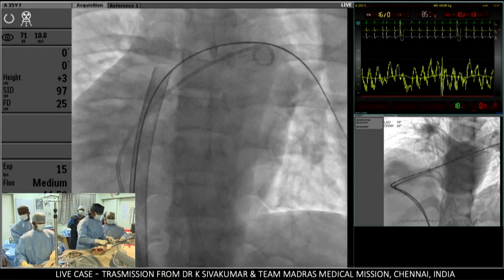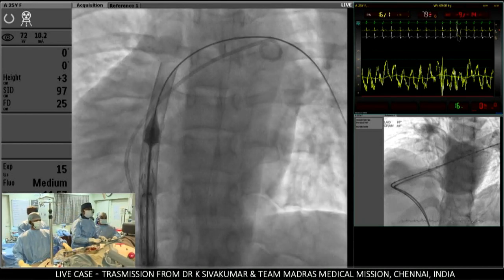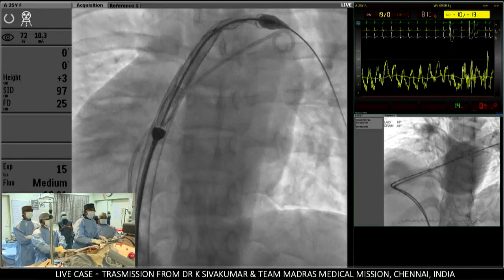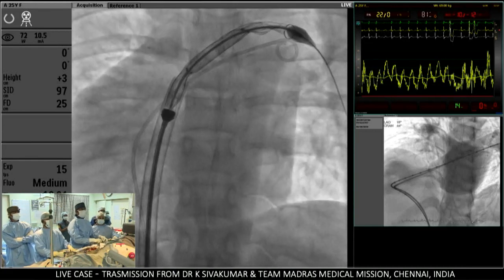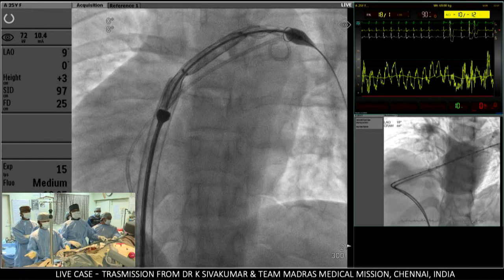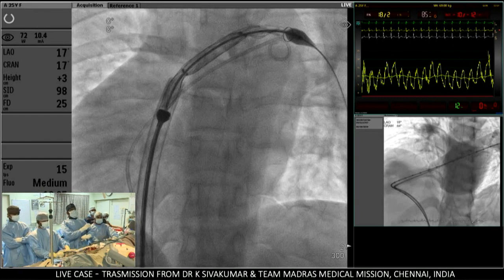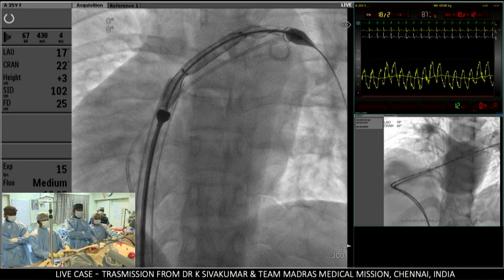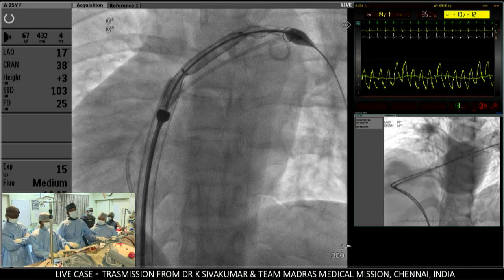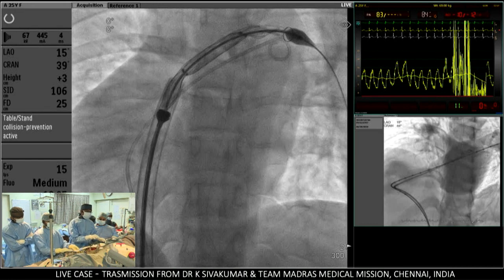I think provided you can put a valve in, there is no way that the stent will be in contact with the wall in the main PA. And I wonder if your intention is to put a valve partially straddling the more restricted point and the RV to PA junction, or what? Yeah, I think that's the only position where the anatomy can hold the device in place. You agree with that? I agree, Mario.